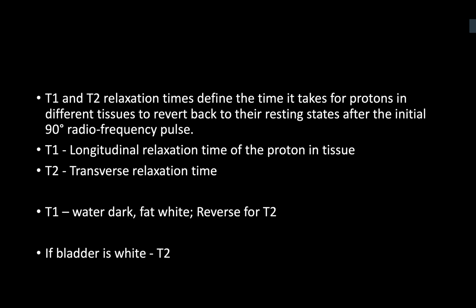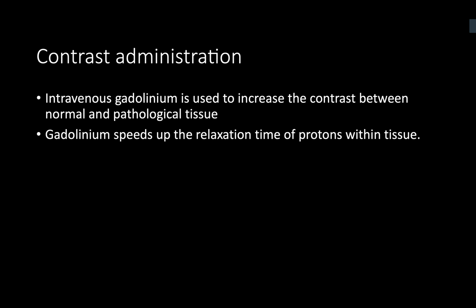How can you differentiate a T1 and T2 in a prostate MRI? So the way to differentiate is mainly by the appearance of fluids. So fluids would appear white in T2 images, whereas in T1 fluids will appear dark. Okay. So you said about the multi-parametric. What are the parameters that we look for in a MP-MRI? So this mainly constitutes 3 sequences. So T2 weighted images, contrast enhanced images, and diffusion weighted images.